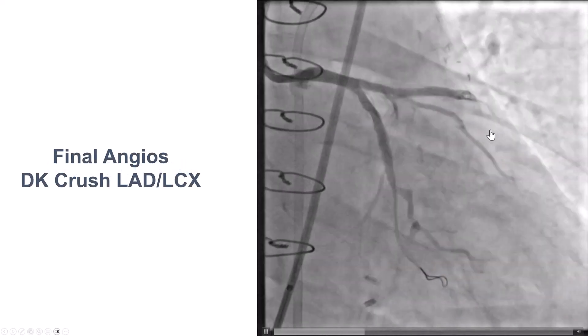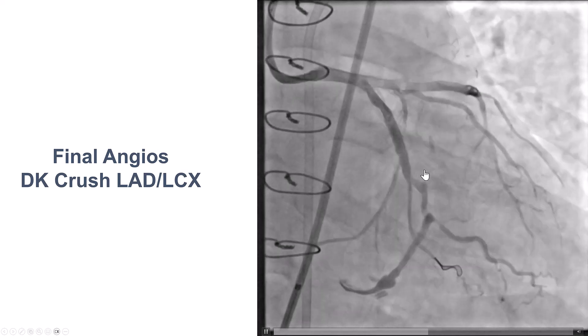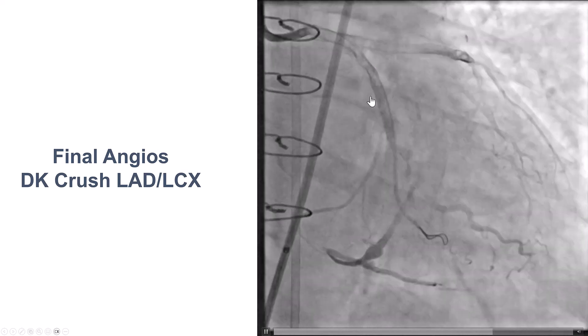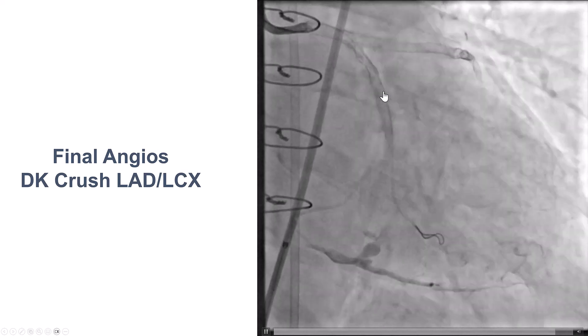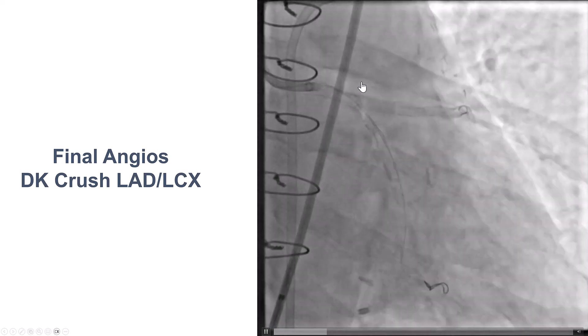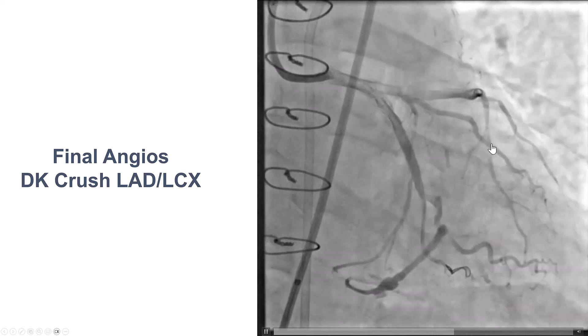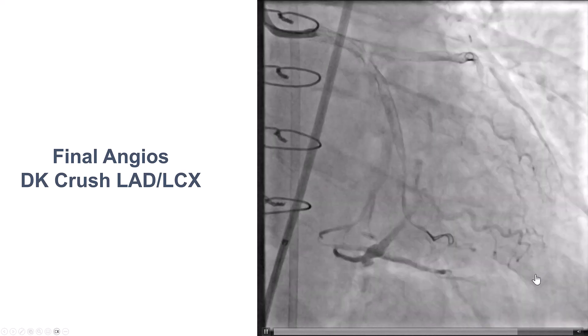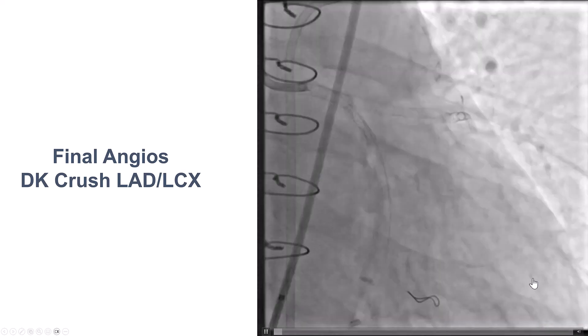We placed stents, and then we did stenting of the left main bifurcation using DK crush. This is the final result with good flow into the LAD.